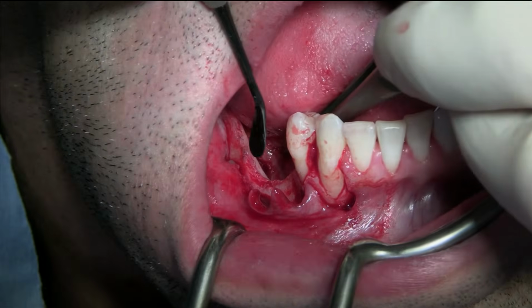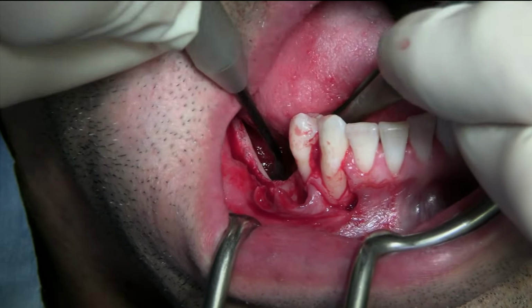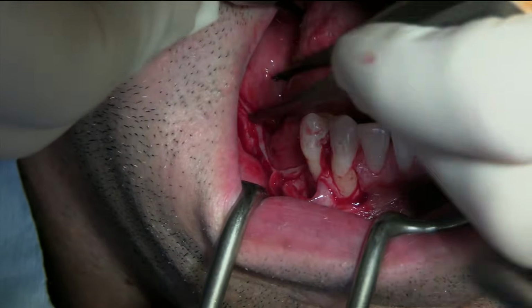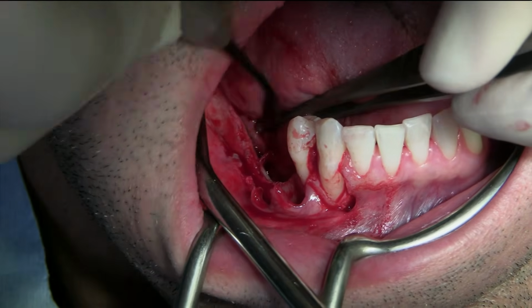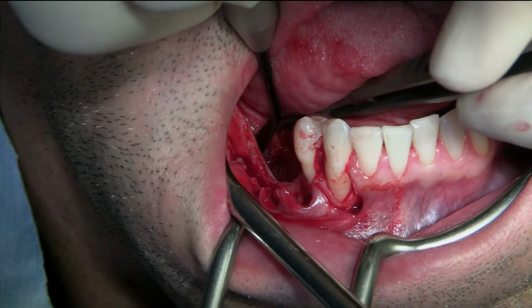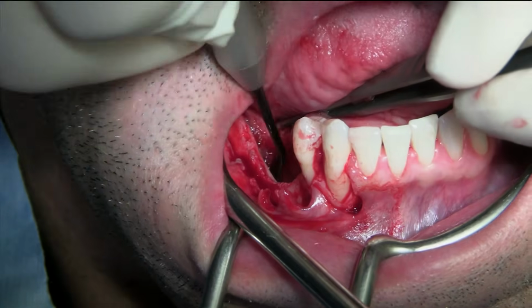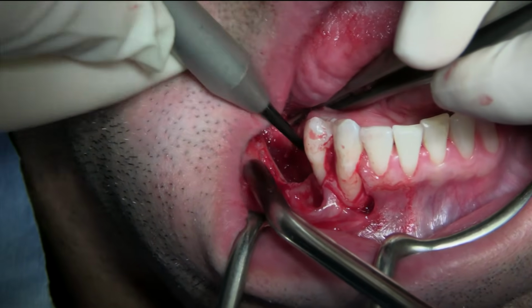Put an instrument here on the lingual that gives me a little curve so I can get towards the mylohyoid ridge. Here's already the dip. It's going lingual as an undercut. The anterior is a little bit more straight.